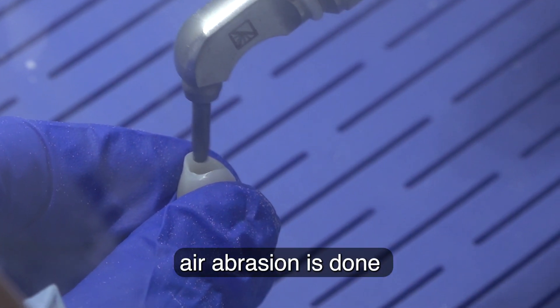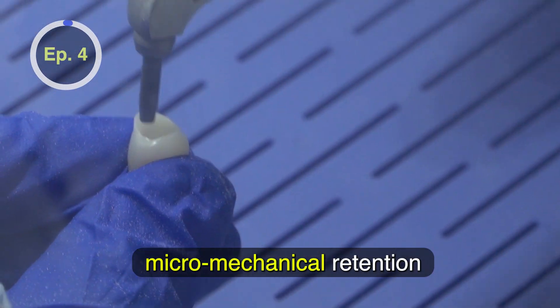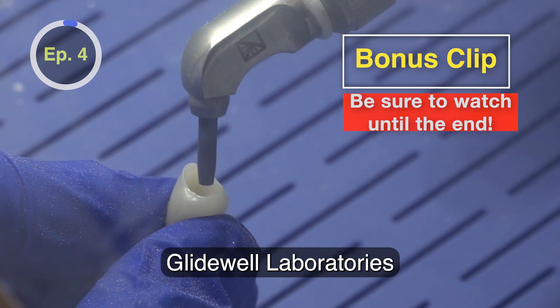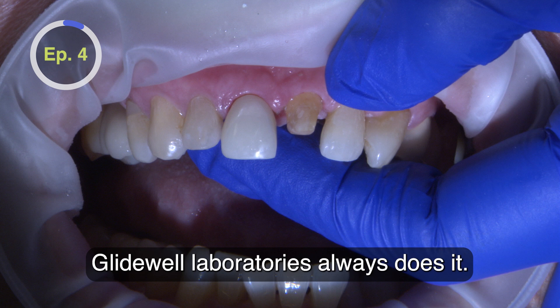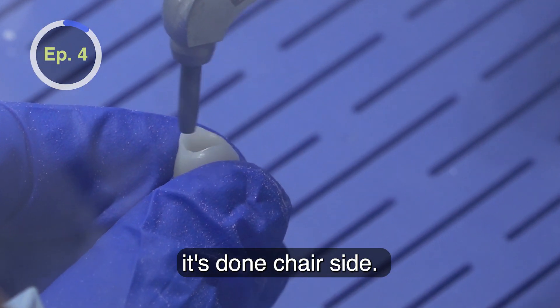Air abrasion is done to the inside intaglio to enhance micromechanical retention of surface area with the cement. Glidewell Laboratory always air abrades or sandblasts. For in-office Bruxer Aesthetic zirconia crowns, it's done chair-side.